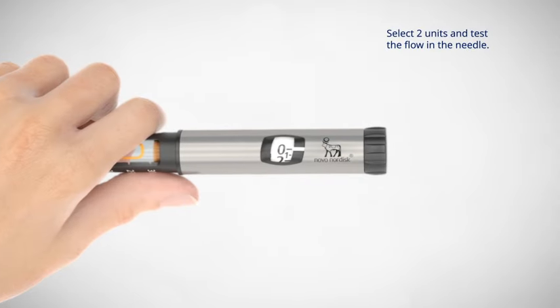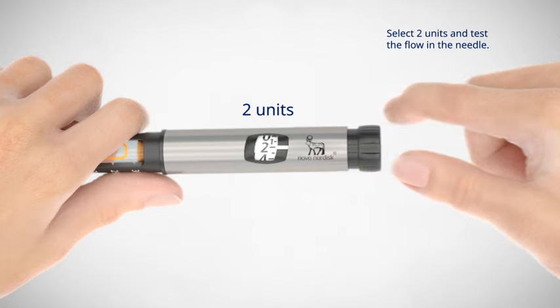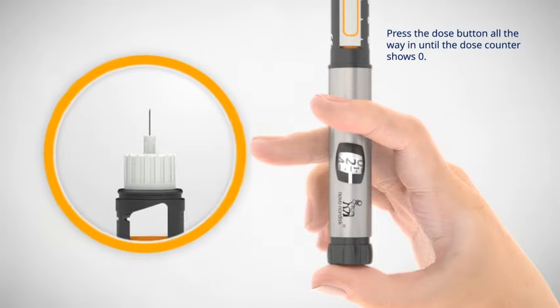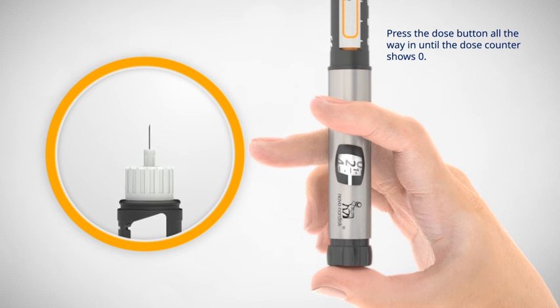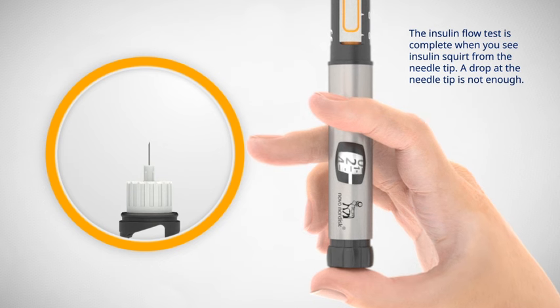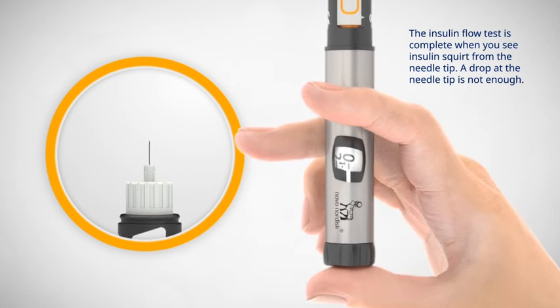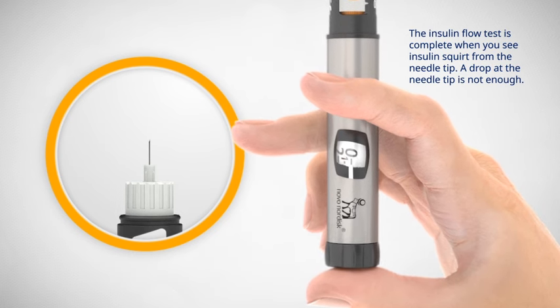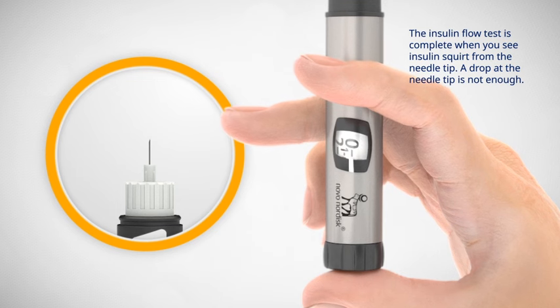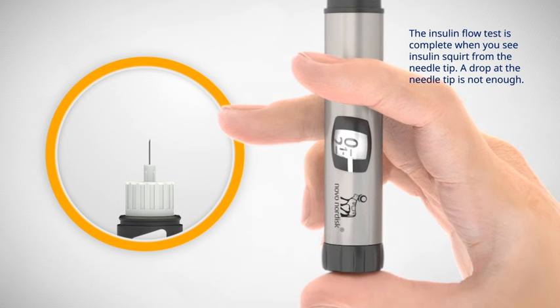To test the insulin flow, pull out the dose button and turn it to select 2 units. Press the dose button all the way in until the dose counter shows 0, and make sure insulin squirts from the tip of the needle. Repeat this procedure if insulin does not appear. The insulin flow test is complete when you see insulin squirt from the needle tip. A drop at the needle tip is not enough.